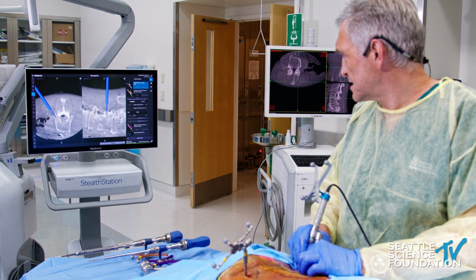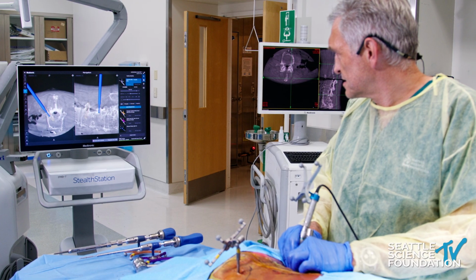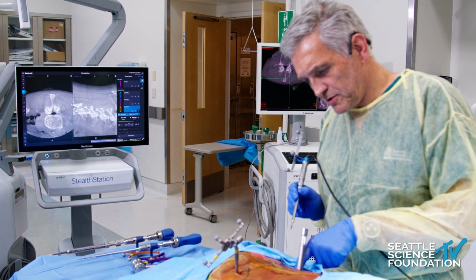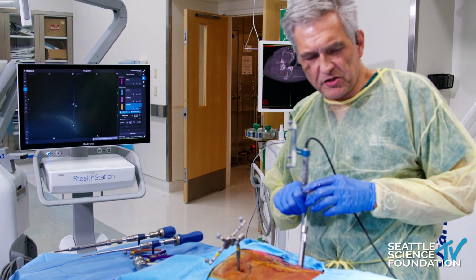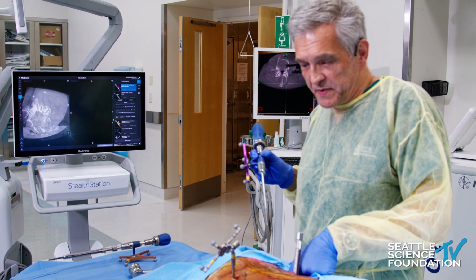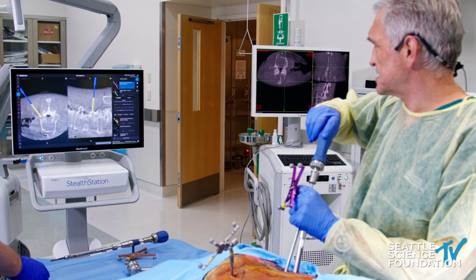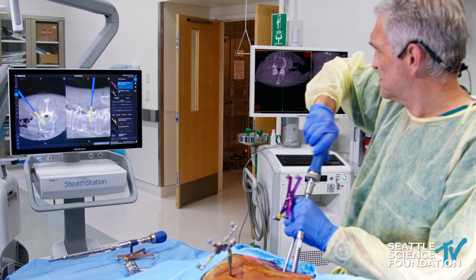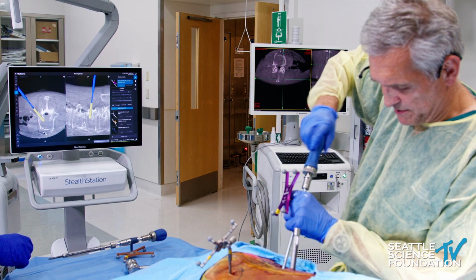So I drill the hole for the L4 screw. I really like this navigated drill. You won't tell your Brainlab friends. But again, obviously, if you have a concern, yes, you should get the X-ray and you should get a confirmation or a spin. Don't get me wrong, safety is the most important thing here, and this is the tap. But I tell you, that navigated drill is really something.